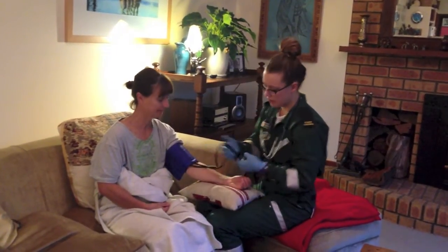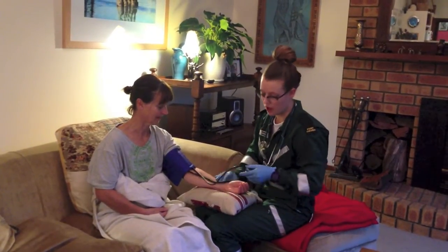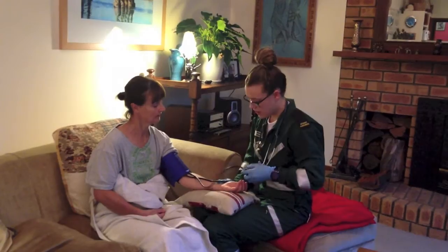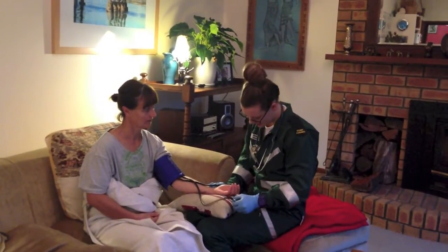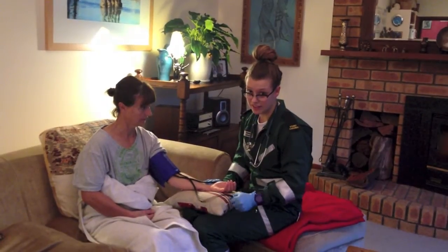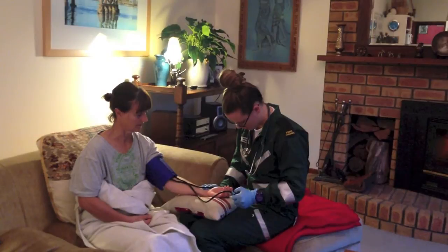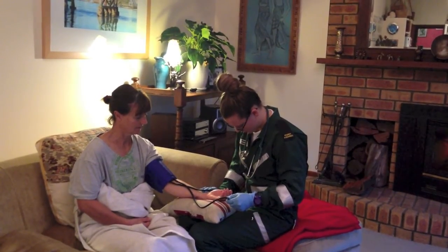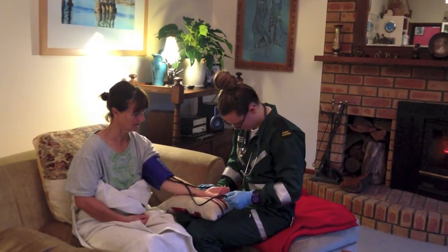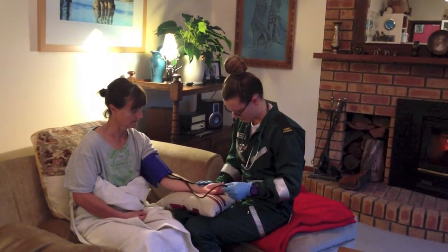Okay. So now I'm going to find Mrs. Jones's radial pulse and pump the cuff up until a point when I can't actually feel it anymore. Then I'm going to pump it up about 20 past this and slowly let it out until I can feel it again. When I start to feel this pulse again, that's her systolic reading. So Mrs. Jones has got a systolic reading of 110 at the moment.